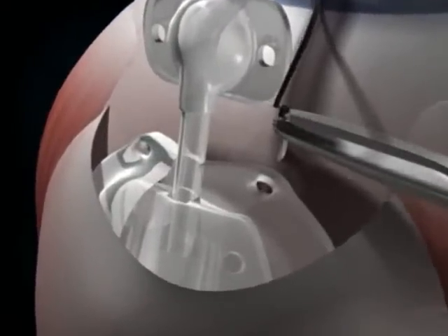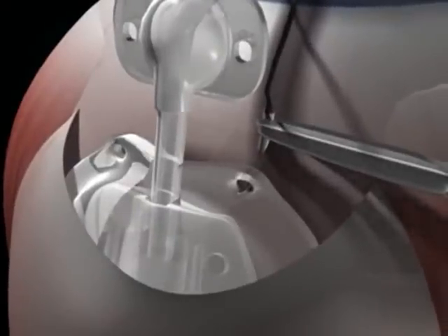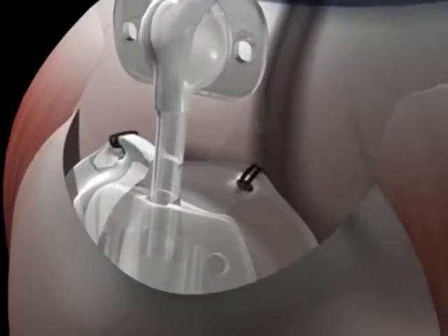2 sutures are placed through these holes given a half-thickness bite of sclera. The valve will now be secured in position on the sclera in between the rectus muscles.